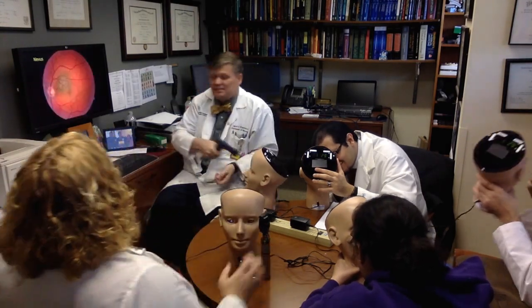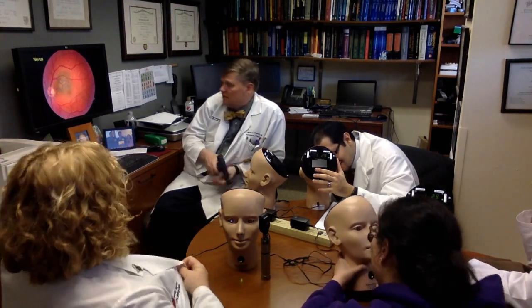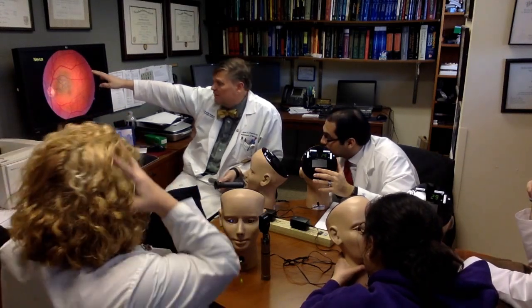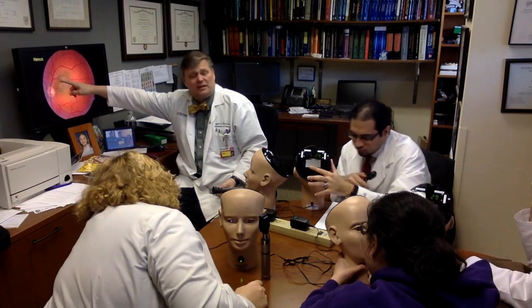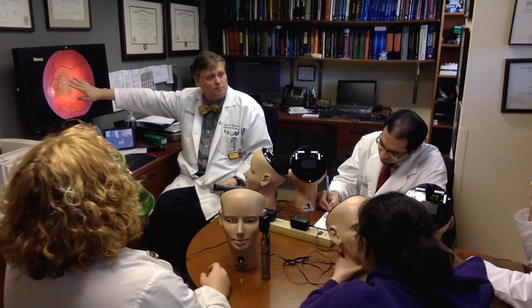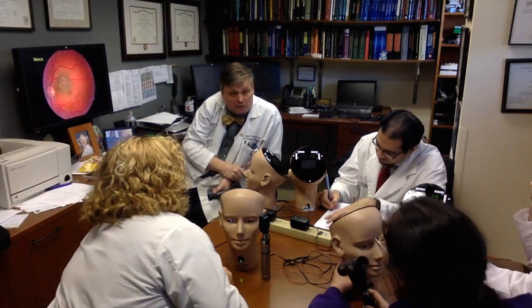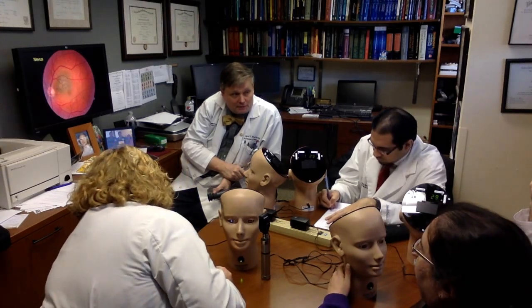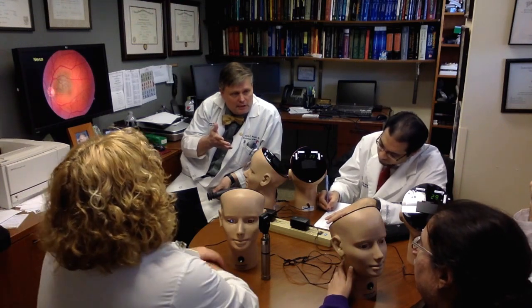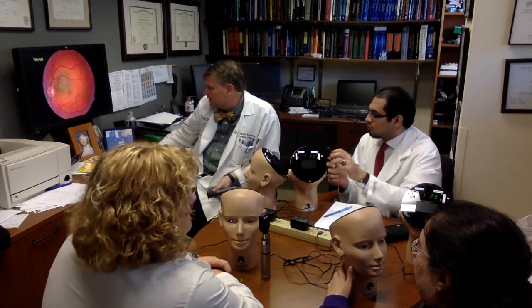Okay, so this is a nevus. This is the difference between a mole and a melanoma. They're both pigmented, both blue-gray pigmented. The nevus tends to be flatter, tends to have margins that are not as well defined, and tends to have some atrophy in the middle. Now, you and I are not going to make the determination of a nevus versus a melanoma. We're going to call the ophthalmologist, right? But we should be able to recognize it. Do you know how they treat ocular melanoma? They enucleate the eye. Yeah, exactly.